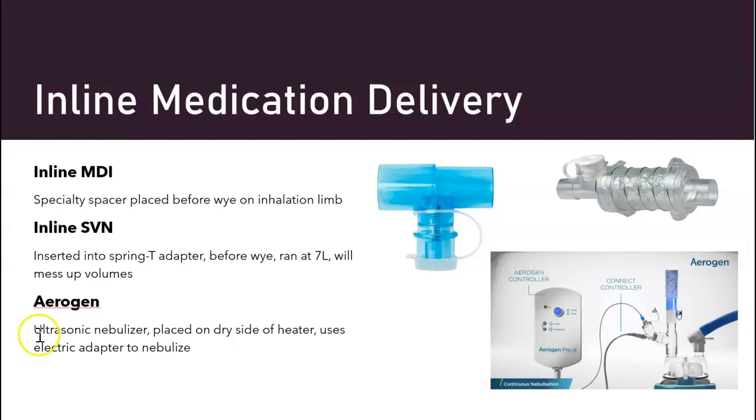And then you can take it out of line, close it. Another thing is this can kind of turn. Make sure it's upright, because if it's sideways or anything, that med can just dump into the circuit, and then the patient won't get any of the medication. I've seen that happen too.